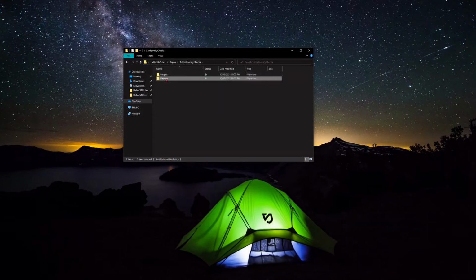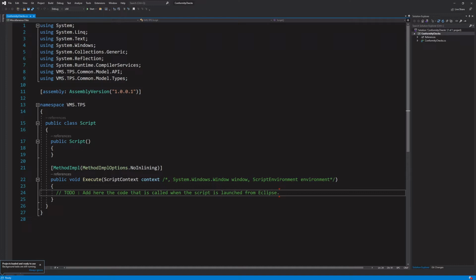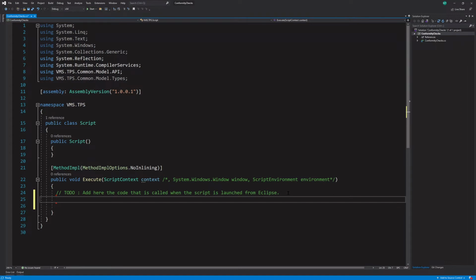Okay, so we're going to hopefully run through this pretty quickly, because I want this to be the simplest form that this could be at all. So we have this script context, and this is the context of whatever patient that we've run it in. If there's not a patient open or whatever, we don't need this, because all we're going to do is present a message to the user with whatever the values are.